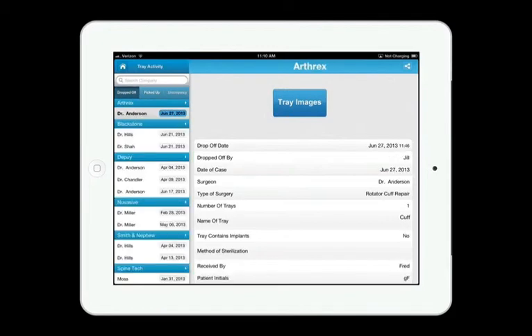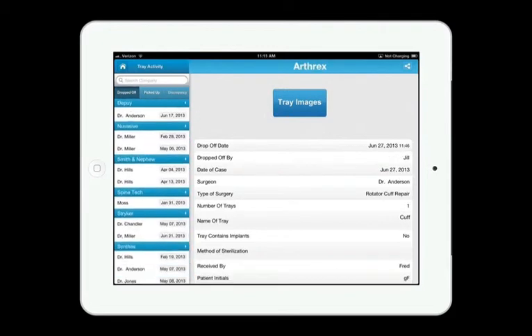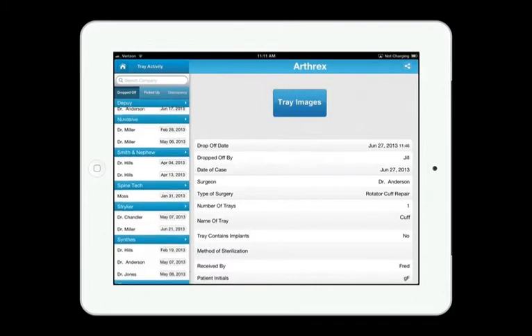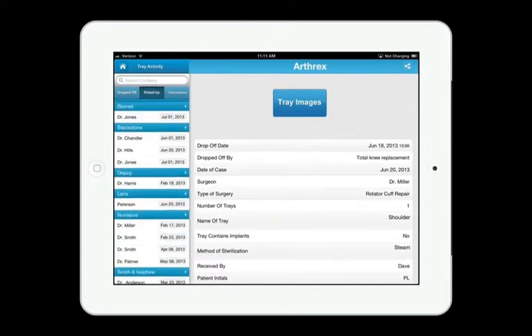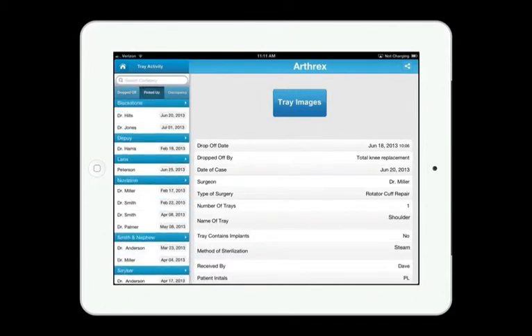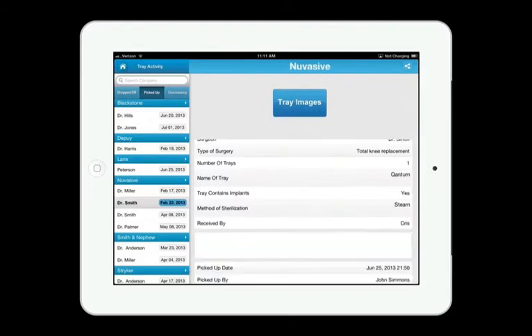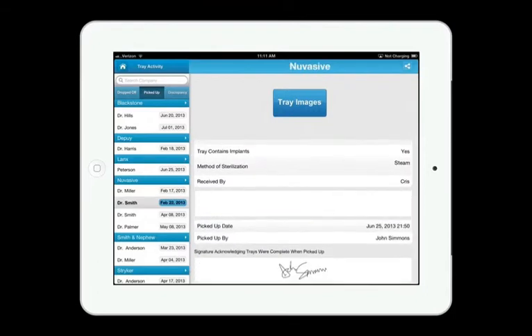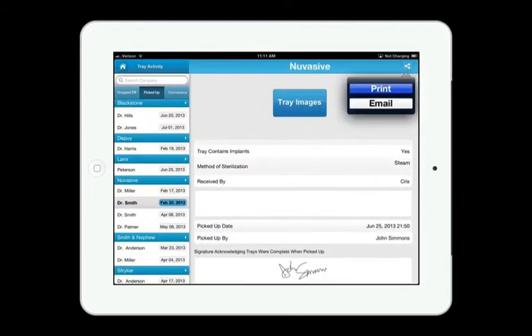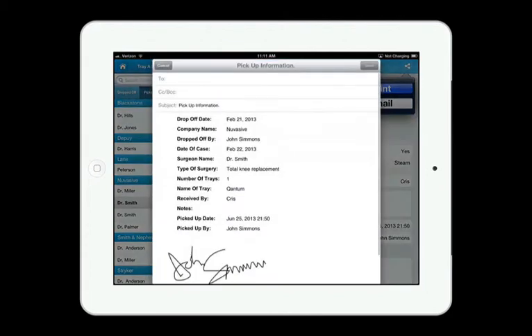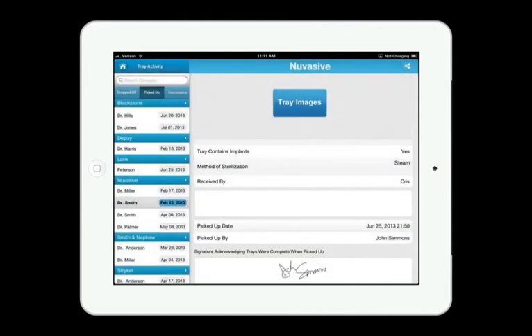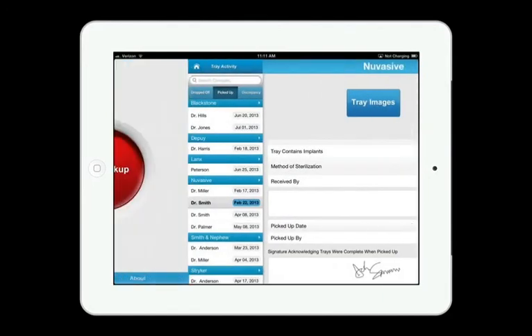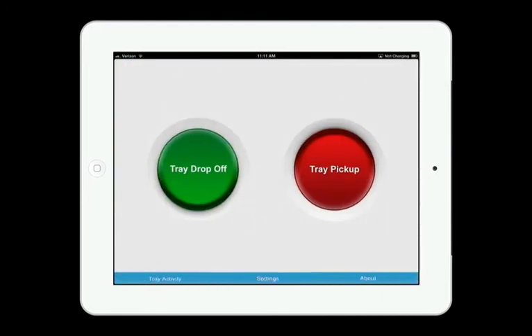So if you have a vendor that comes to you a few days after he's picked up his trays and tells you that he's missing an instrument, you can pull those up and show them that those trays were complete and signed off when they were picked up. You can print or email a copy of that for him and let him know that he needs to look for those instruments at another hospital. And all that information is readily available and accessible with the TrayTracks system.